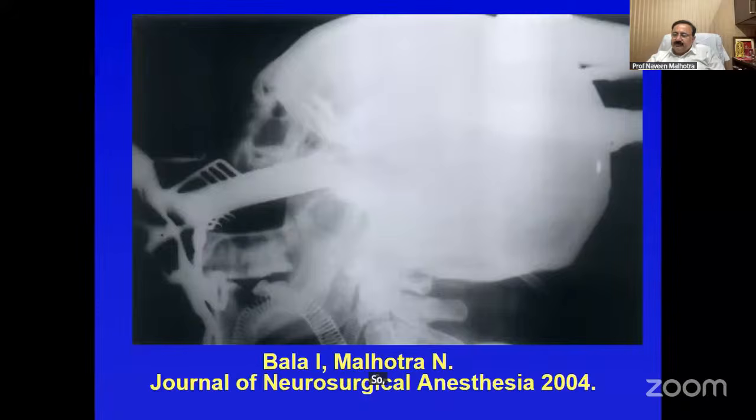If you can see here, the maxilla and mandible are opposed to each other, so oral intubation is not possible, and nasal intubation comes into the field. So this is the intraoperative X-ray where the submentotracheal tube is lying in a patient with clival chordoma.